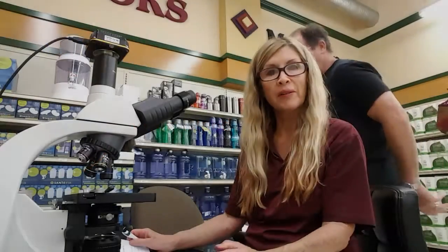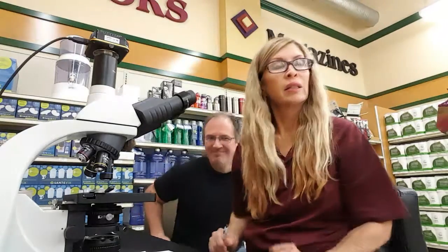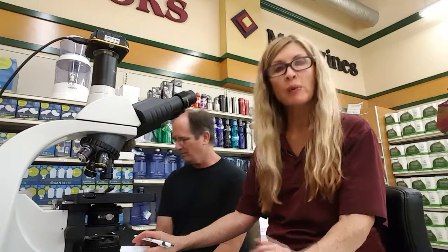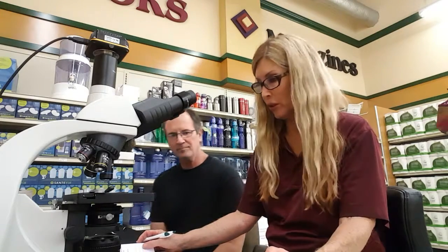Okay, so this is live cell analysis. This is Glenn. He's my patient. And what we're going to do is he's going to fill out his waiver first. That discloses whether I'm a non-professional medical person. It's just that I'm giving my opinion by what I see.